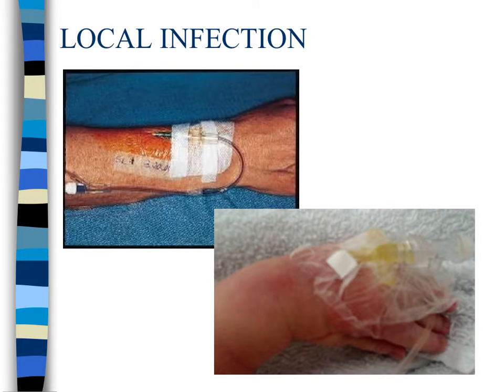Prevention includes inspecting all solutions to make sure that they are intact and not discolored or leaking or have any issues with the container, as well as good technique during venipuncture and site maintenance. We would document all findings and interventions.